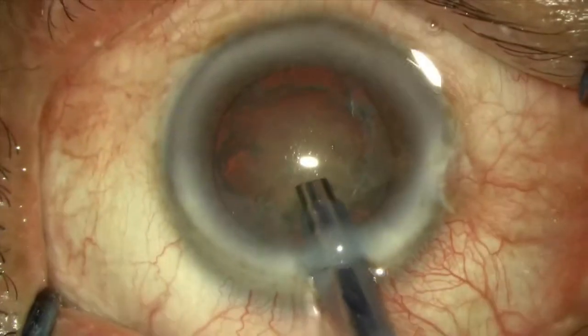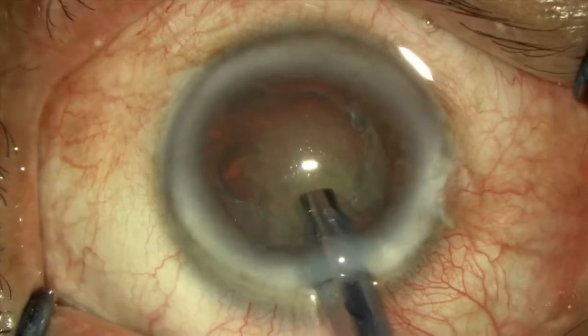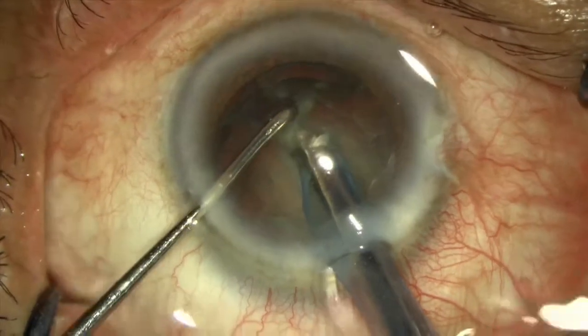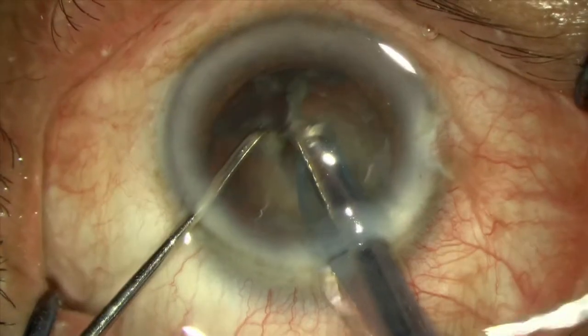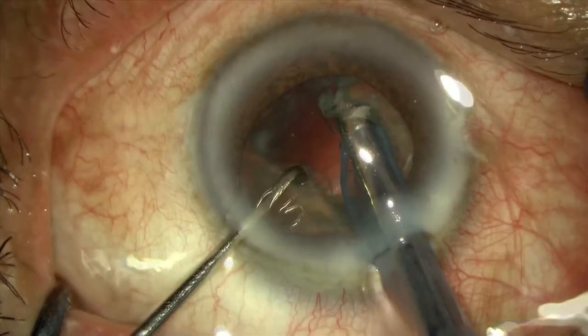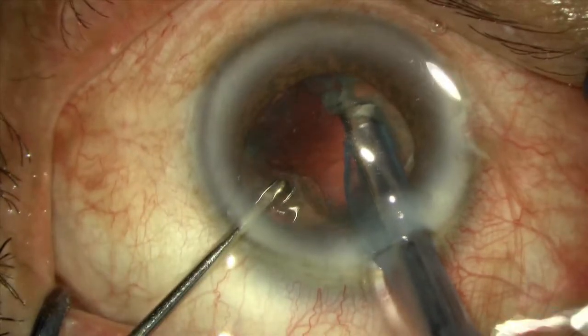Terminal chop is about utilization of unique mechanical forces to pull apart and split the nucleus from its weakest, soft and thin equator along the anatomical arrangement of lens fibers to achieve full-thickness nuclear segmentation in hard mature cataract.